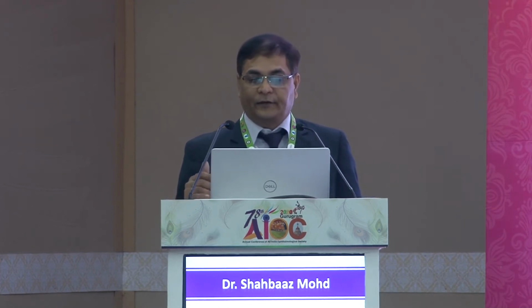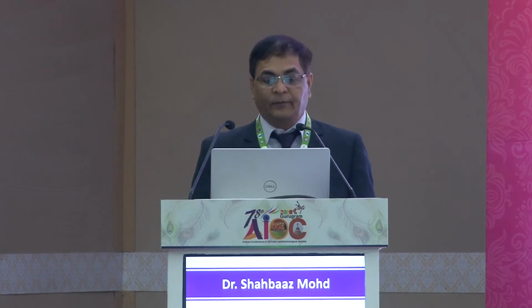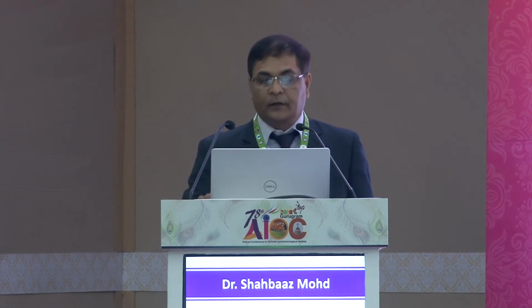A transducer is used to send ultrasound pulses, usually 8 to 10 megahertz, to create a sound beam which passes through the eye. The sound beam is reflected back at interfaces of changing tissue density like the anterior capsule, posterior capsule, retina and sclera. These echoes are displayed as vertical spikes rising from the baseline. The time taken for the sound wave to return is converted into distance, using the velocity of sound through the various tissues.